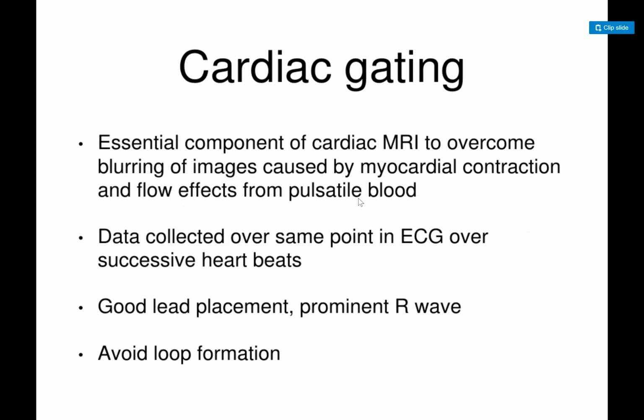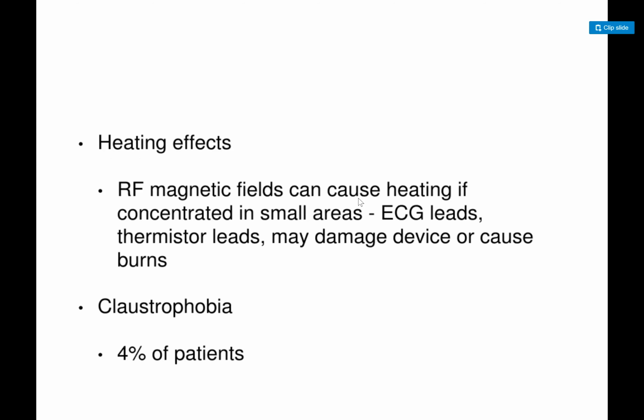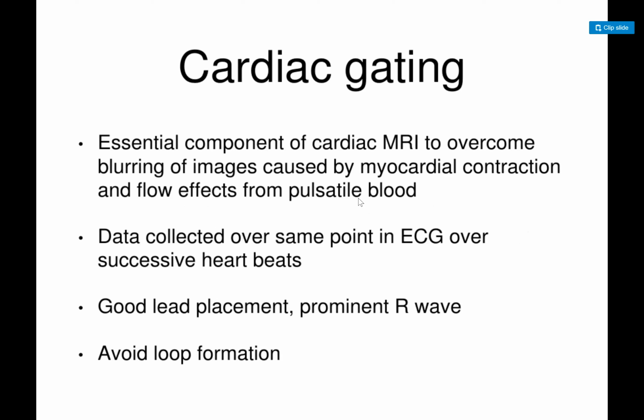Okay. 4% of the patients can have claustrophobia, and that's a big issue. So usually we give some form of sedatives before taking them to the MRI. In some places, it's difficult to give IV medicines without the presence of a physician, and usually radiologists do not call themselves physicians. So you need to have another physician at the bedside to give those medicines.